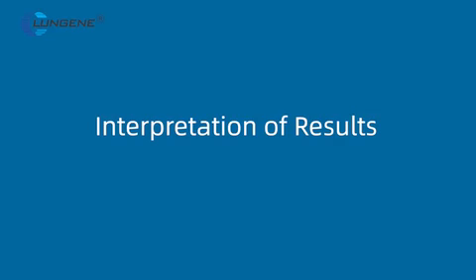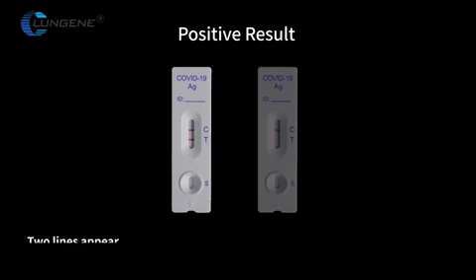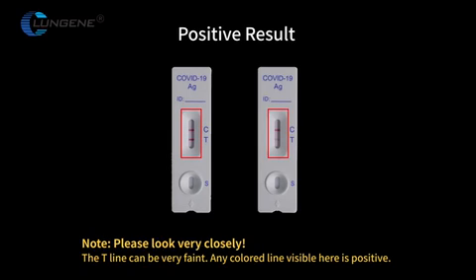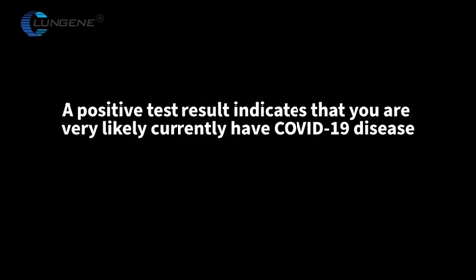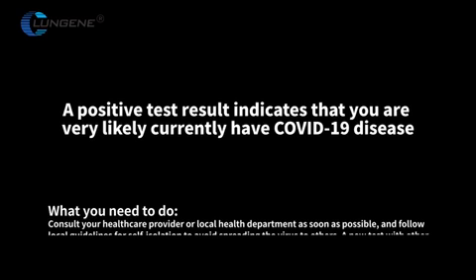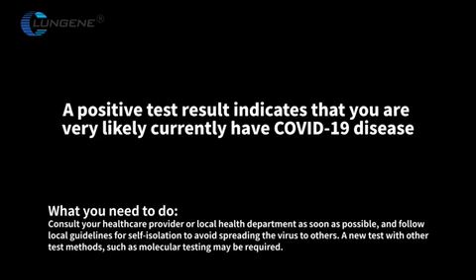Positive result: Two lines appear. One color line appears at the control region C, and another appears at the test region T. Please look very closely — the T line can be very faint. Any color line visible at T is positive. A positive test result indicates that you are very likely currently infected with COVID-19. Consult your healthcare provider or local health department as soon as possible, and follow local guidelines for self-isolation to avoid spreading the virus to others.